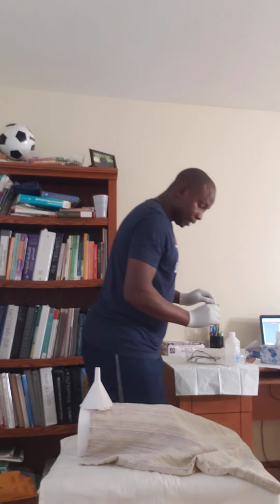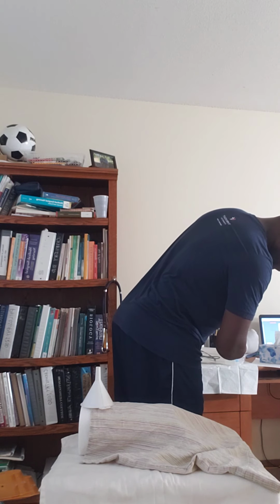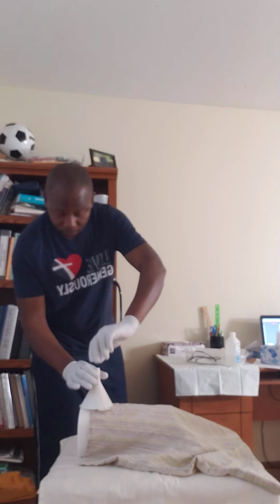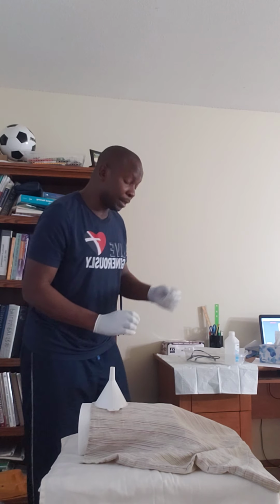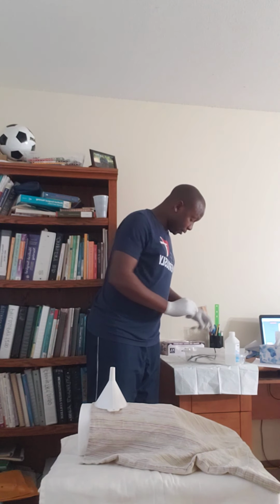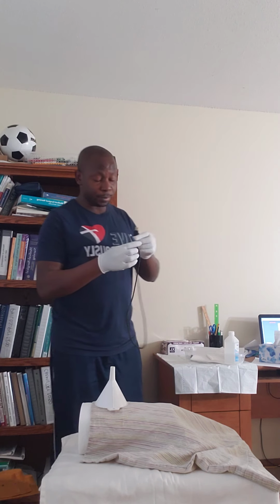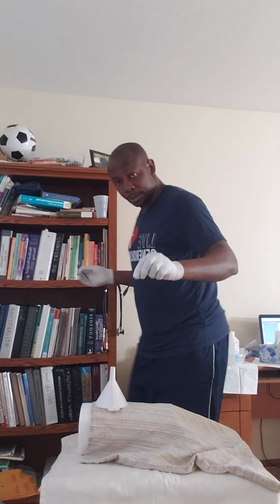Then the cannula will be removed. Now I'm removing the cannula. I'm pressing the cannula in the saline and the hydrogen peroxide to be cleansed. There is that kit, and there is the water where I'm pressing that cannula. So now I'm going to press my tubing.